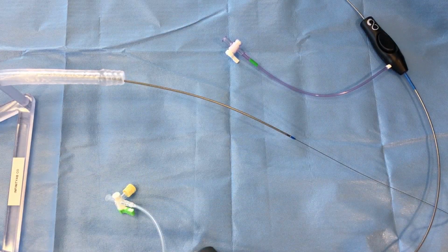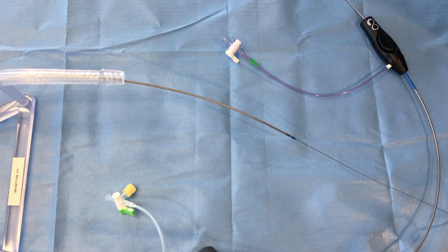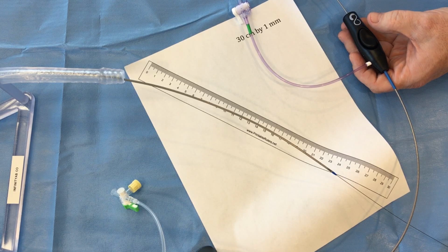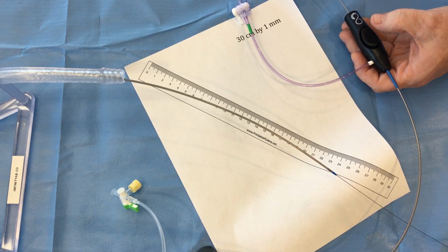The Infinity Angioplasty Balloon has been advanced across the aortic bifurcation and down the contralateral femoral artery. The tip is positioned on the guide wire. The balloon can then be exposed for the length of the lesion. The accuracy can be to the millimeter.